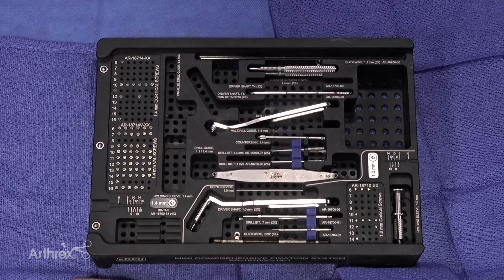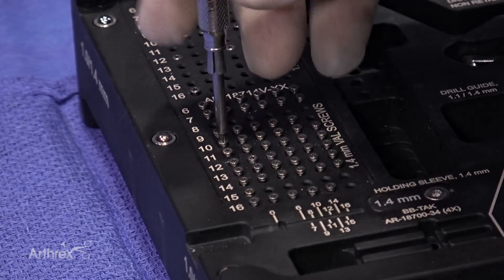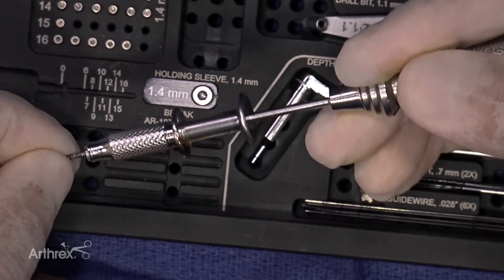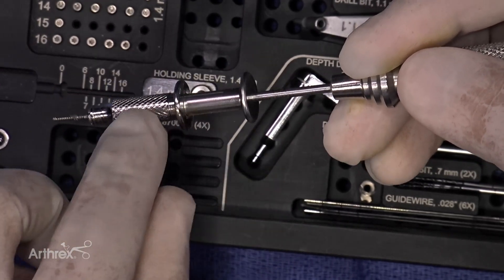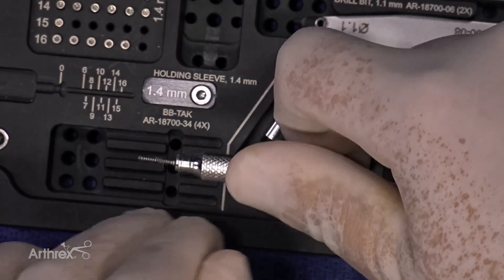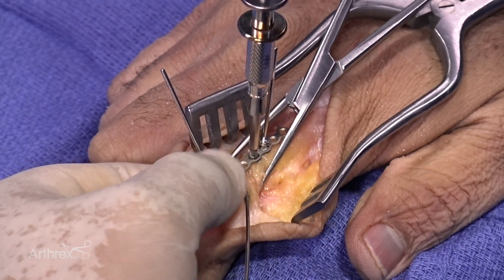I want to show how nice the screwdriver and the locking mechanism is to hold the screw. I'll put in a 10 millimeter screw and engage the locking mechanism — you'll feel a beautiful, positive click. The sleeve has a spring-loaded mechanism with a very positive and direct click. Once engaged, you do not need to do any additional pushing or tightening with your fingers. There are different screwdrivers in the set to appeal to just about any hand surgeon, and the retaining screw comes off easily, allowing this to be done all in one step.